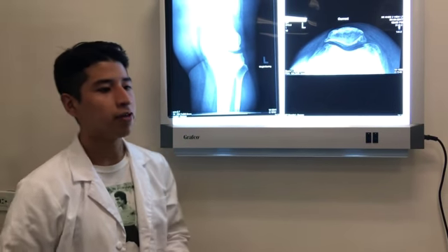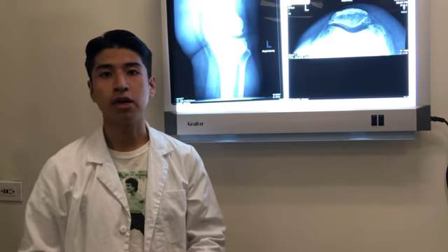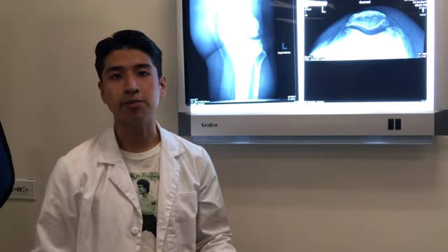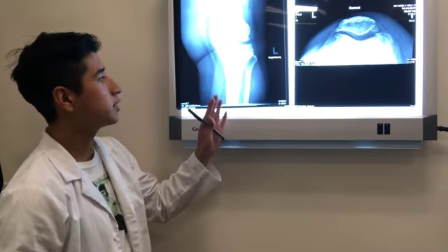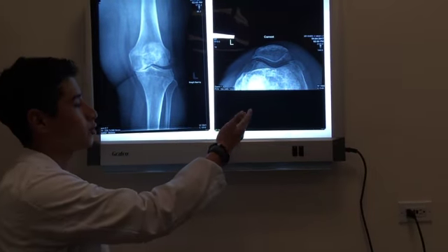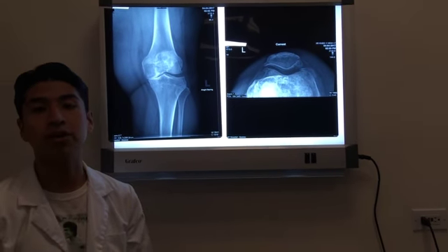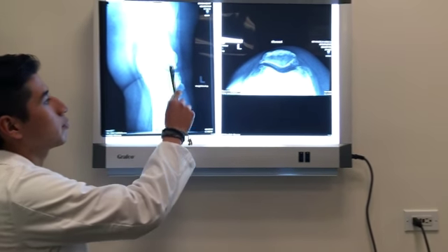I also felt like I could have worked more efficiently when I brought the patient into the room. The room was not set up, and that's something I would like to work on, to have everything prepared so that when the patient comes in, the procedure won't take as long. And as well as certain technique factors with osteoarthritis and other diseases, I want to know when or not to increase or decrease the technique, so that we're able to see any type of pathology on the radiograph.